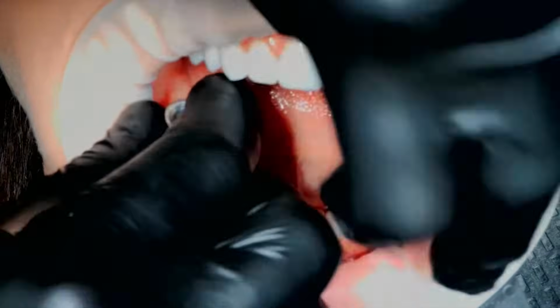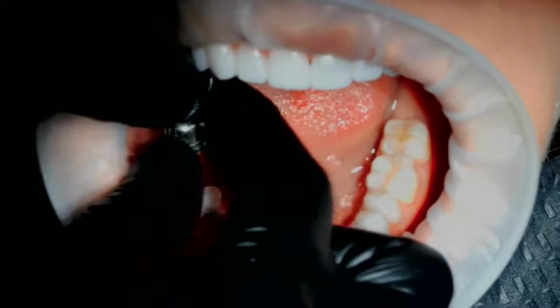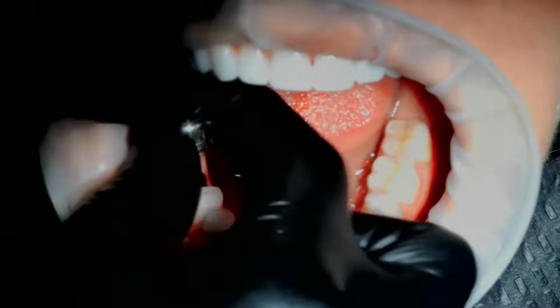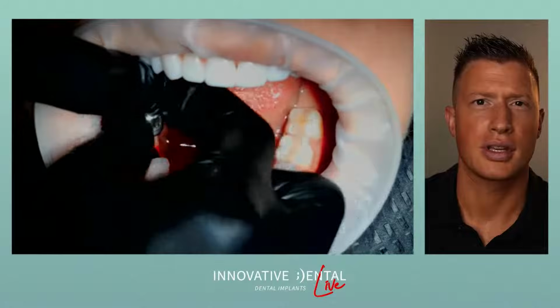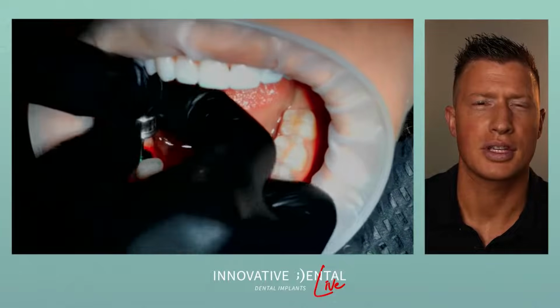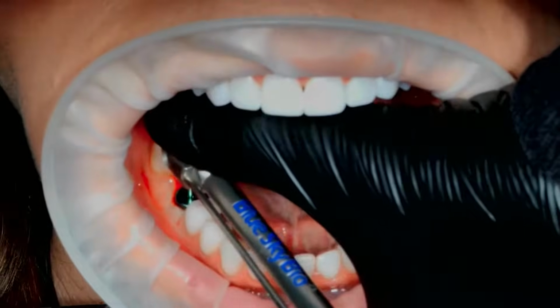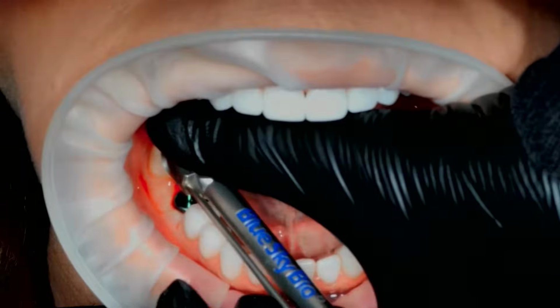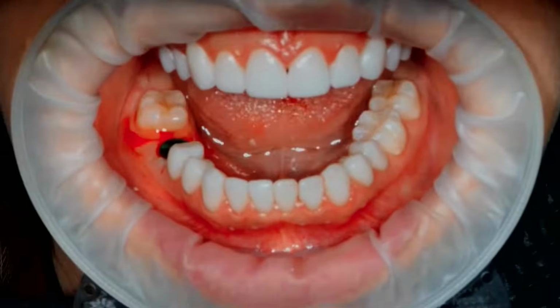All right, here's our healing cap, and then we're going to seat this down on the implant, tighten that down. This one here is a 6.5 healing cap, so it's 6 millimeter diameter, 5 millimeters tall. So yeah, you can see now we're just tightening it all the way down, getting it where that won't get loose during the healing phase. Now we've placed a dental implant and we've taken an impression.